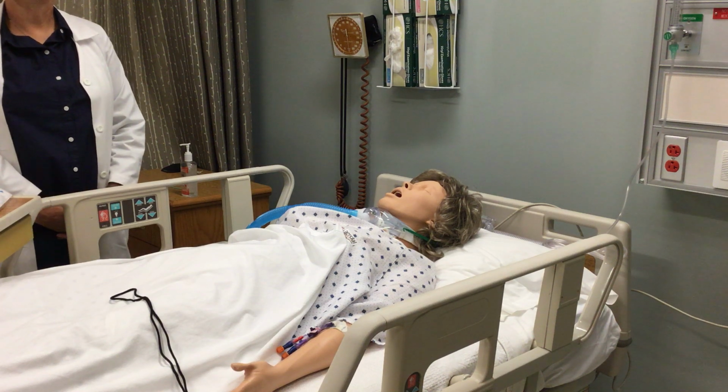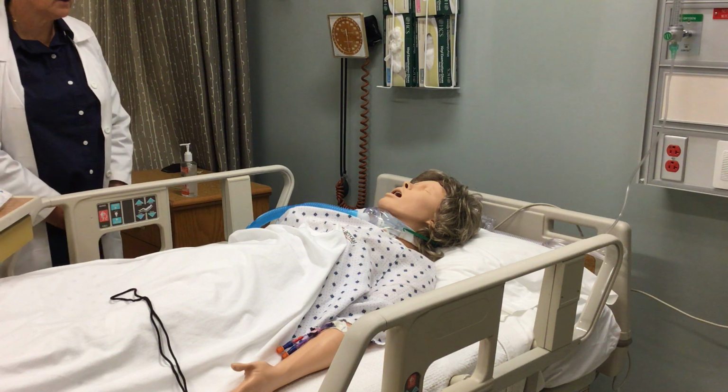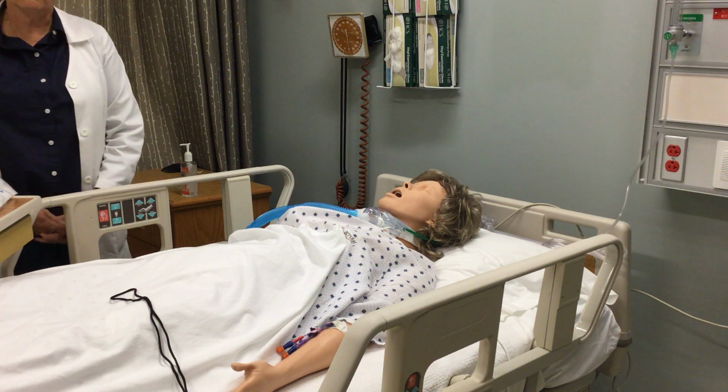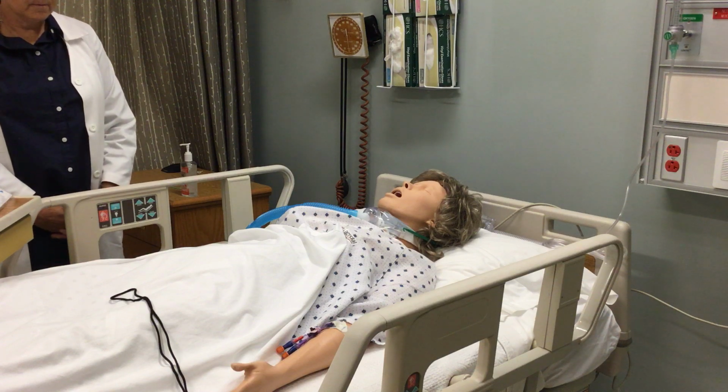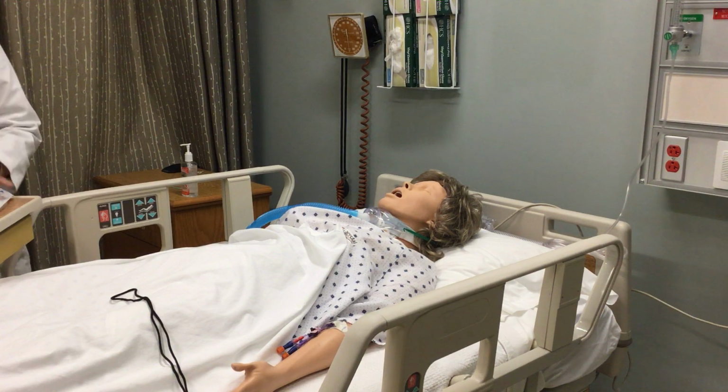This is the video for Tracheostomy Care. Verify the healthcare provider's orders. I've checked the orders and I have to provide trach care, suctioning, and care of the site for this patient. Gather the necessary equipment and supplies.